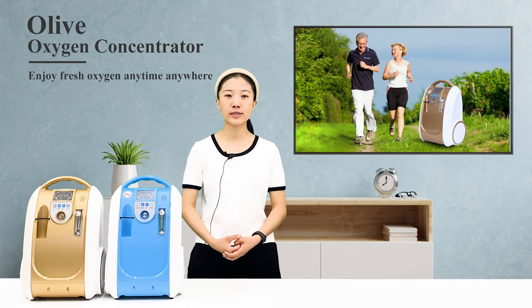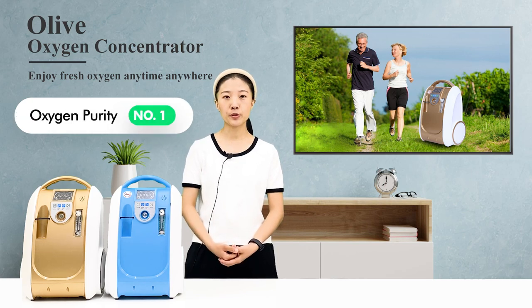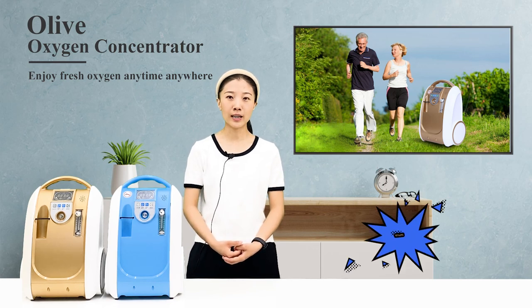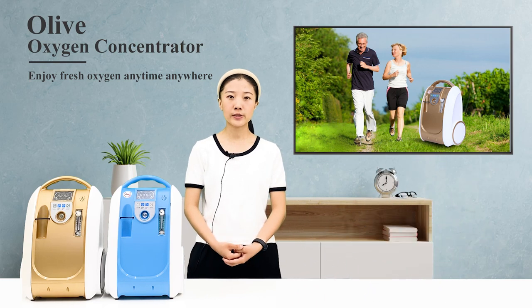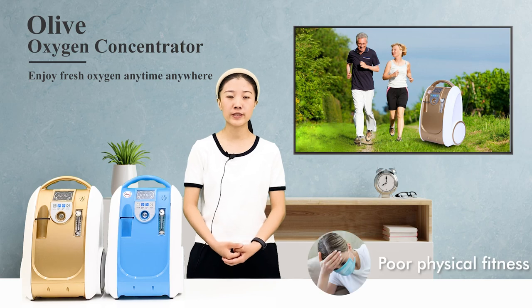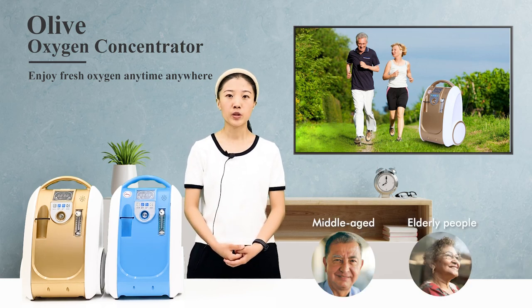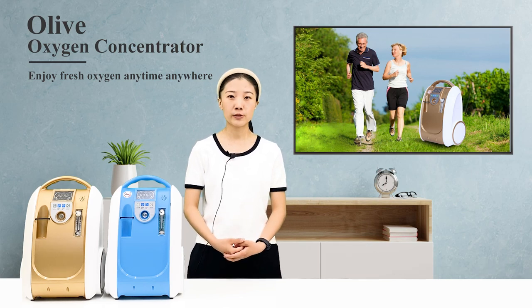How to choose a portable oxygen concentrator product? Number 1: Oxygen Purity. The oxygen purity of the Olive 1 to 5 liters portable oxygen concentrator is as high as 90%, plus or minus 3%. It is suitable for people with poor physical fitness, middle-aged and elderly people, pregnant women, students, and others with different degrees of physiological hypoxia.